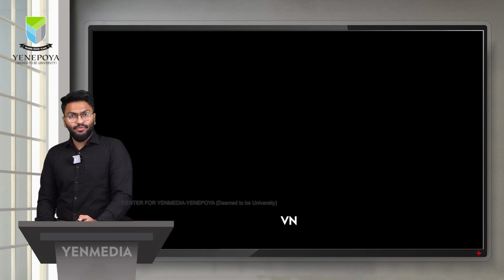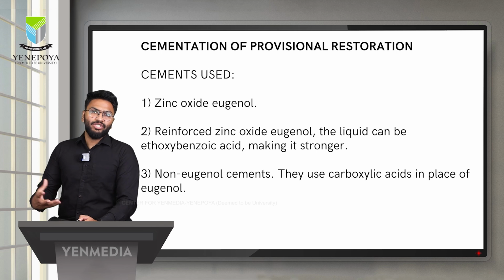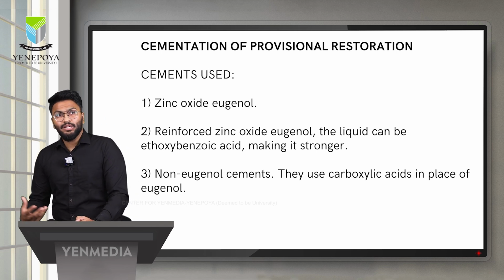I hope that video was informative for you. Now, coming to the cementation, once the provisional restoration is ready, the next step is the cementation.